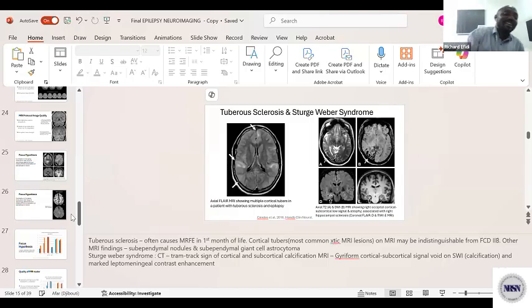So if we are going to explain this to the radiographer, ideally it should be part of their training because this involves MRI acquisition techniques. A radiographer that is conversant with MRI imaging should also be familiar with the hippocampal axis.